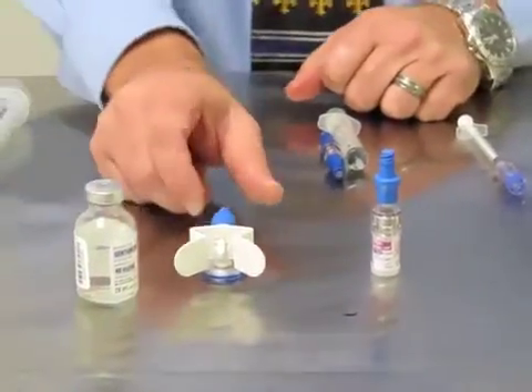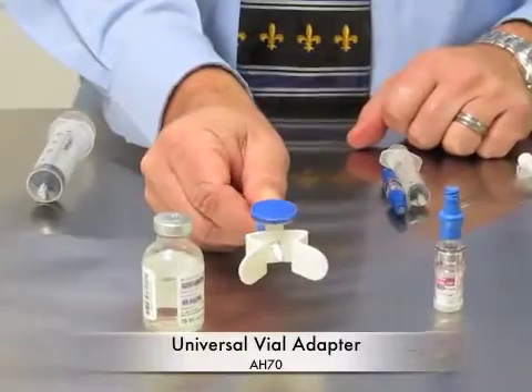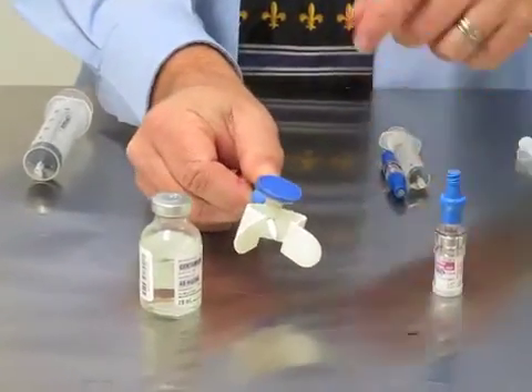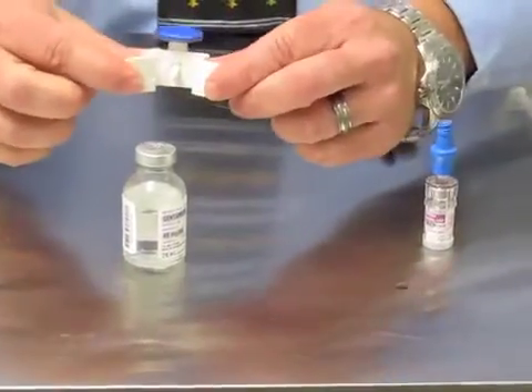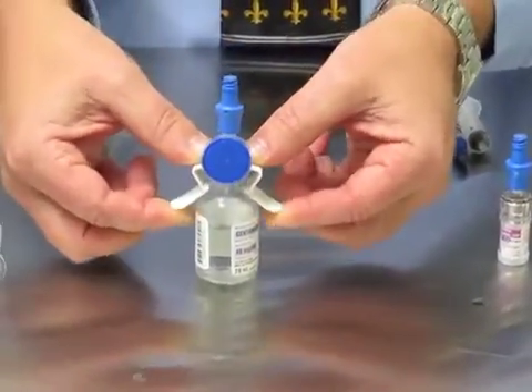The next vial adapter is a vented universal vial adapter. It fits any size vial and it is vented. To place this, you're just going to spread the wings and place it straight down onto the vial.